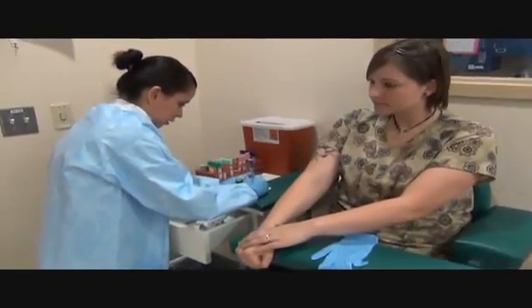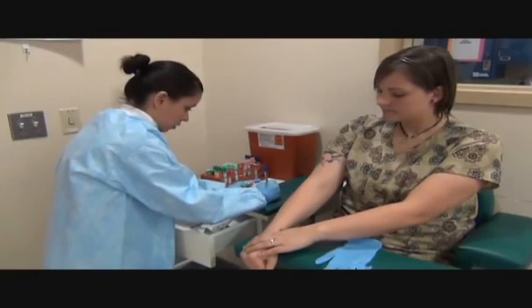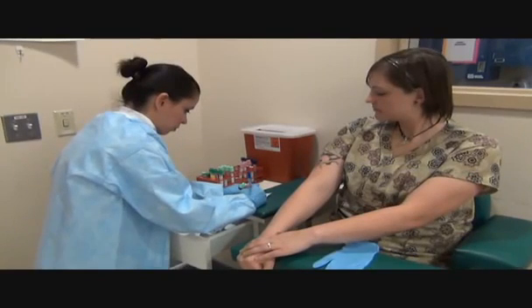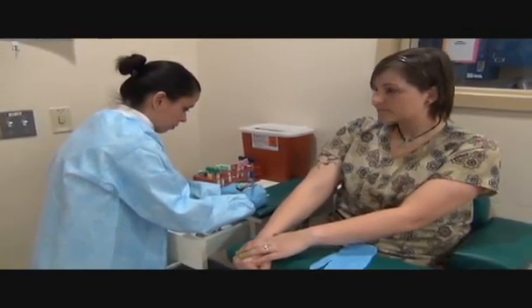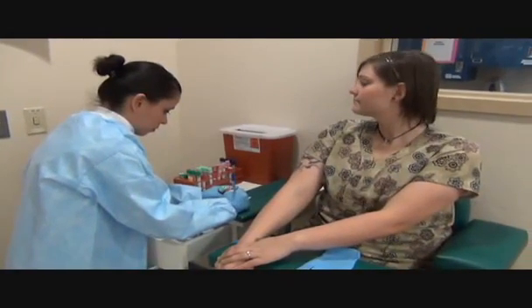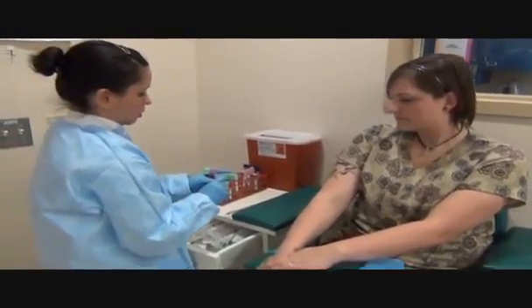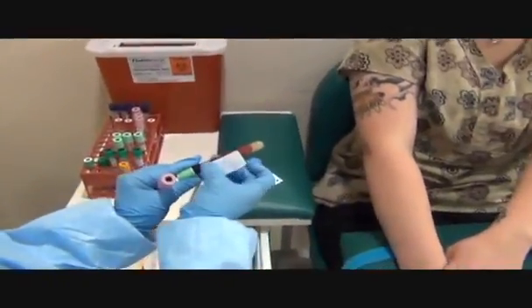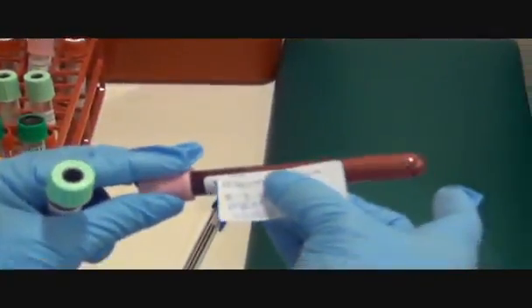I'm going to put the medical record number, the date, the time, my initials, and the test. I'm going to label each tube accordingly. I want to make sure that I don't put it on crooked, and the correct test goes with the correct tube.